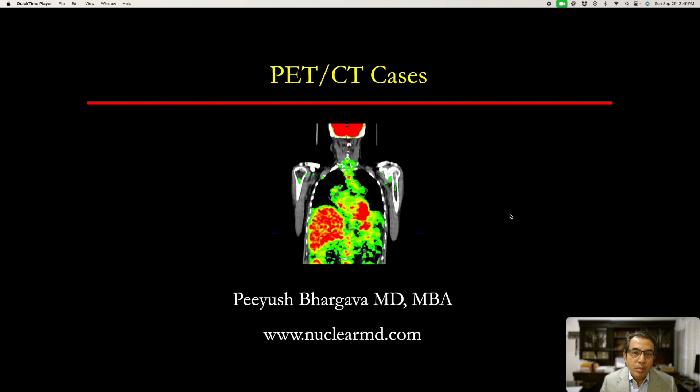Hi, this is Dr. Bhargava. In this short video, I have several interesting PET-CT cases to share with you.